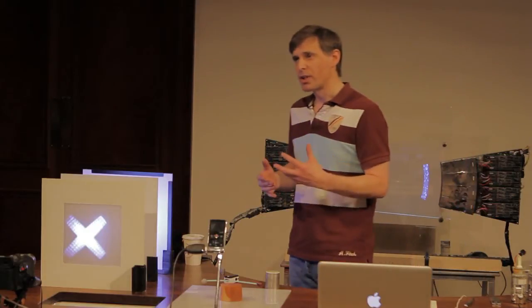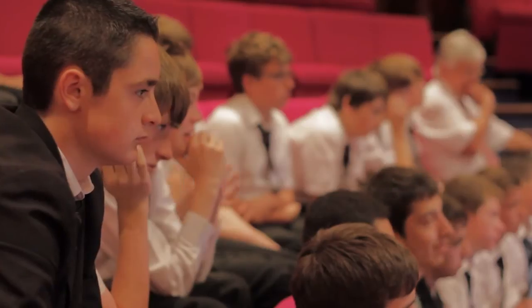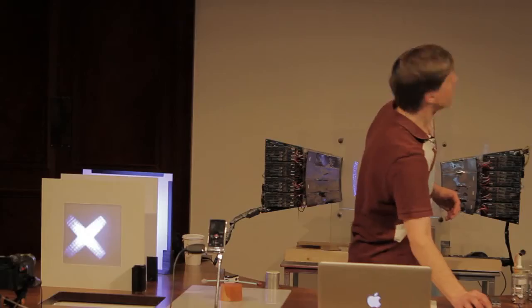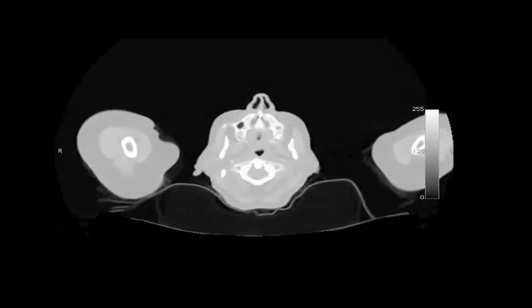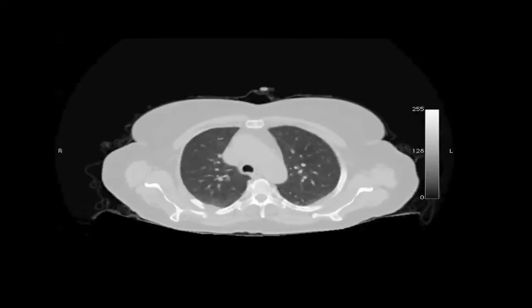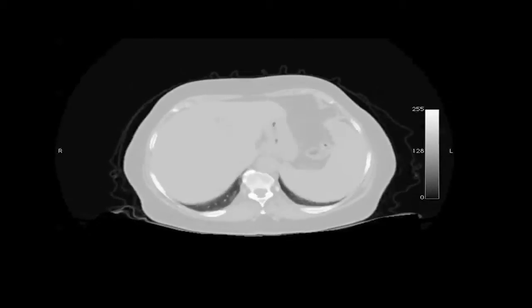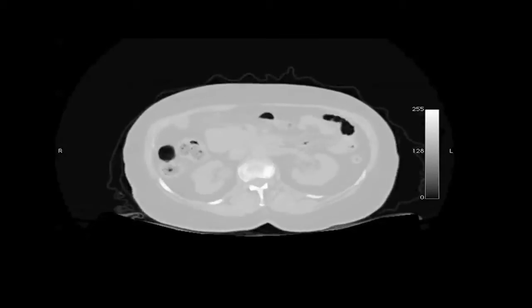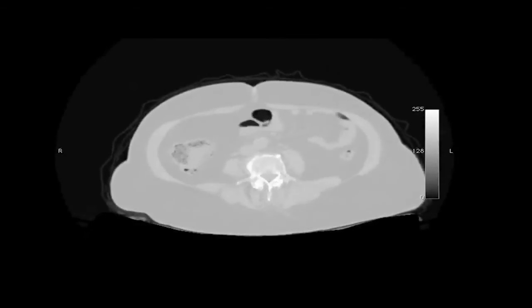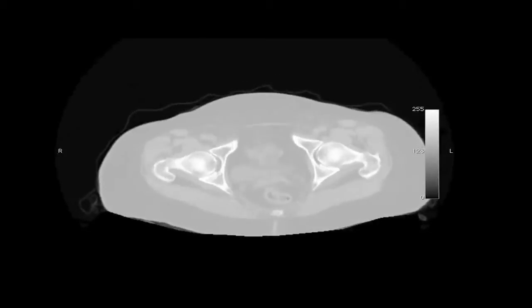That's a couple of ways of seeing inside our bodies, but I'm guessing that some of you are already thinking, hold on a second, if we watch TV programs like House or Casualty, very often the kind of pictures that you see there look more like this. They're not two-dimensional, they're slices through the body. We're seeing here the body in 3 dimensions by slicing it up like a loaf of bread. How on earth do we manage to do that?